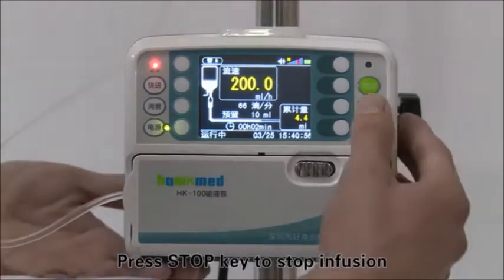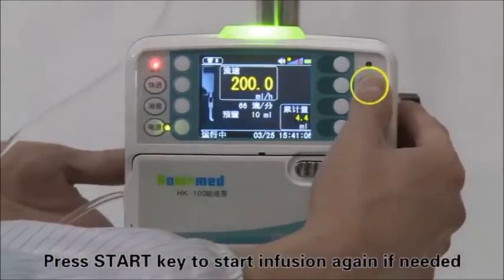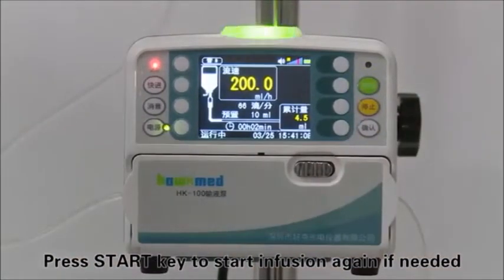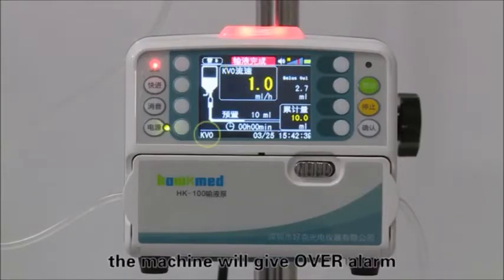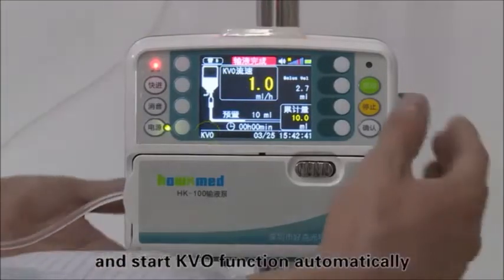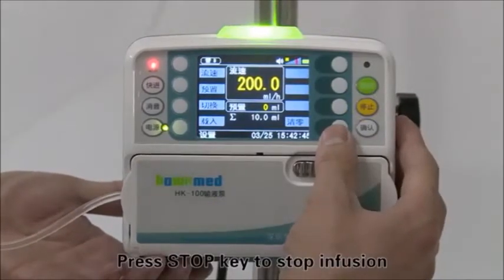Press the stop key to stop infusion. Press the start key to start infusion again if needed. After infusion is complete, the machine will give an over alarm and start the KVO function automatically.